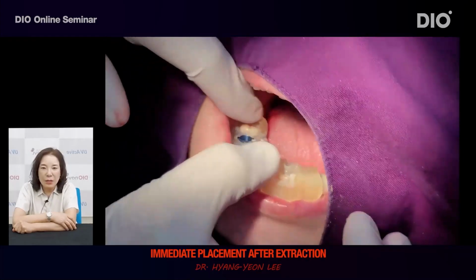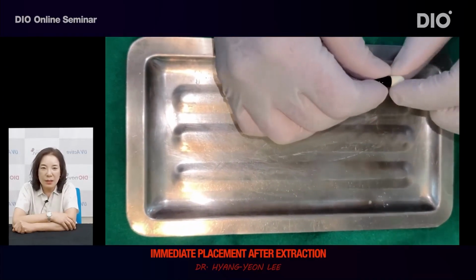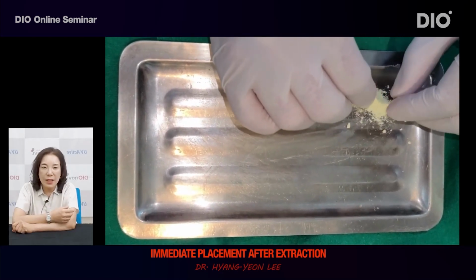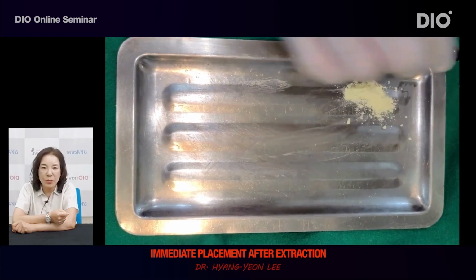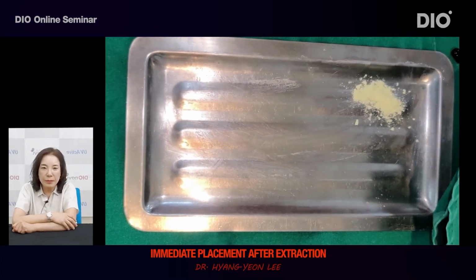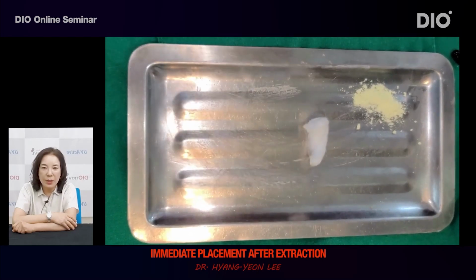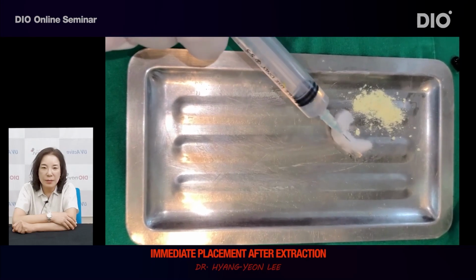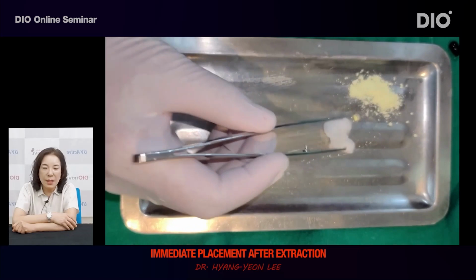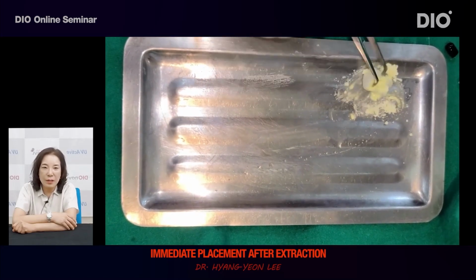Extract the tooth and check whether the guide matches well by inserting the guide. Then, open the doxycycline capsule of the tooth extraction socket. After having wetted disinfected cotton with saline, wet it again with doxycycline and insert it into the tooth extraction socket.